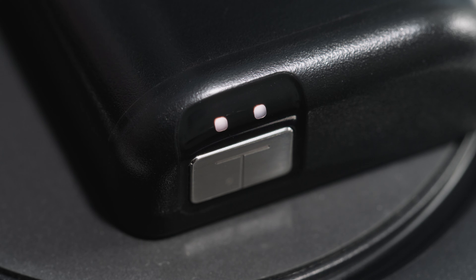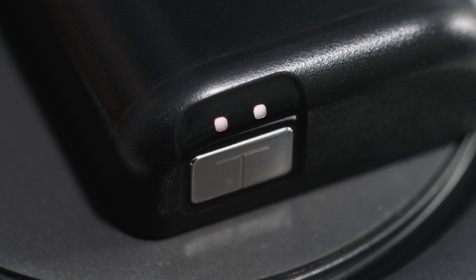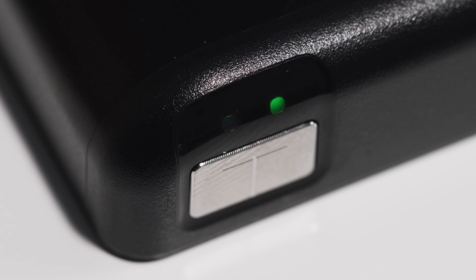White represents either that the pump is charging or insulin delivery has been stopped manually. Green represents basal delivery or a temp basal rate is being delivered.